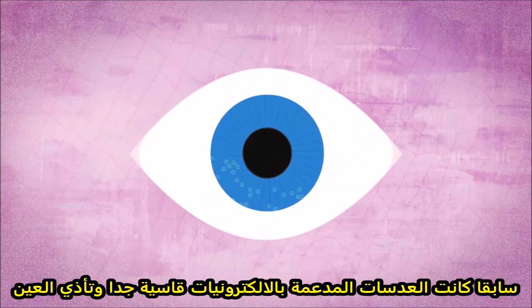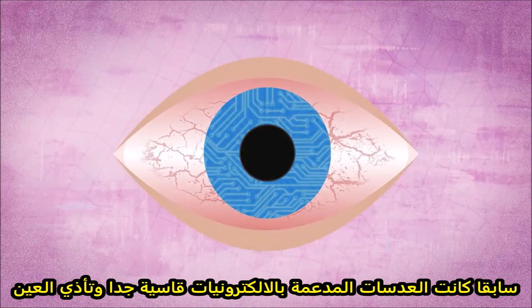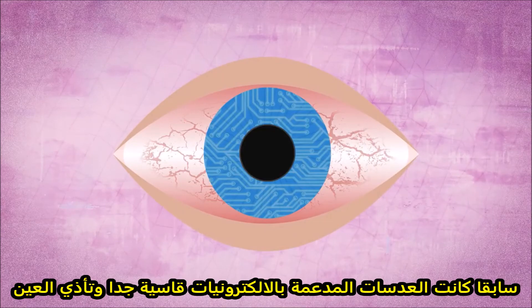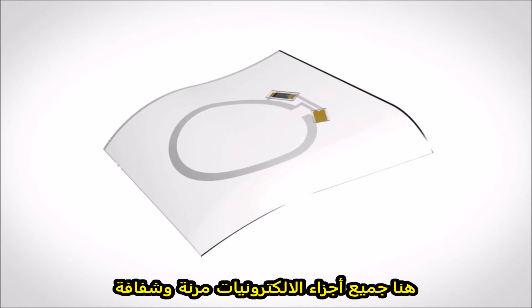In the past, contact lenses integrated with electronics were stiff and potentially harmful to the sensitive human eye. Now, the components are all flexible and, for the most part, transparent.